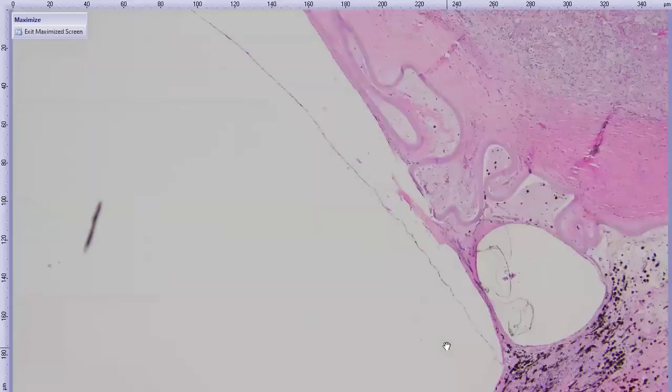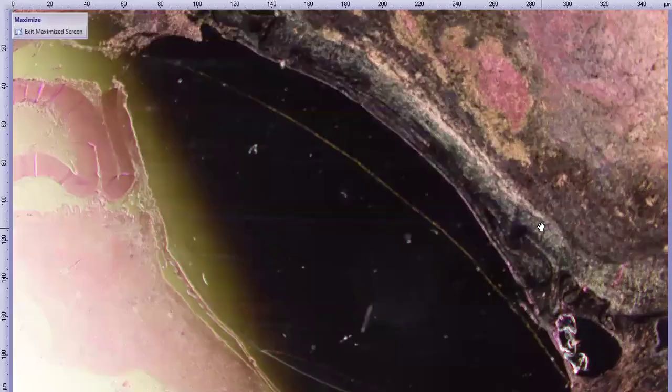All right, back out one. So here's the region of that intraocular lens. I can run my finger under and we can see kind of this refractile structure there. So we didn't catch it in section or didn't come off the slide, which is nice.